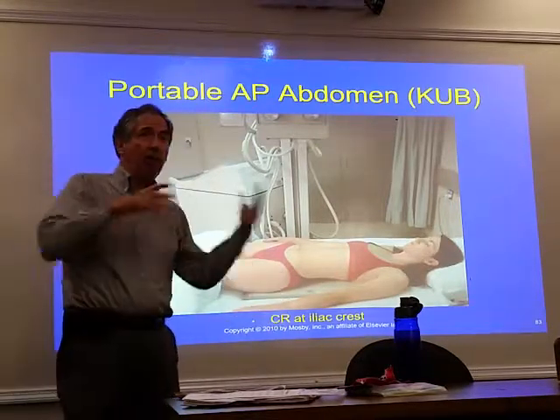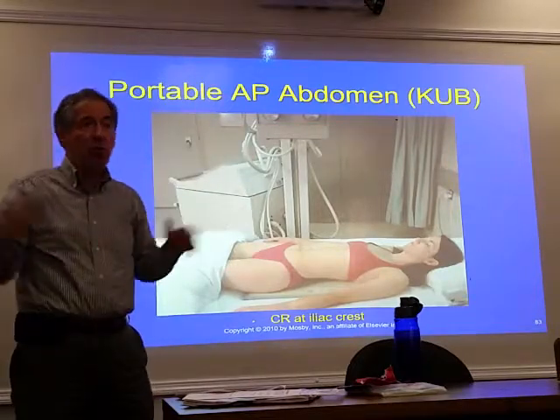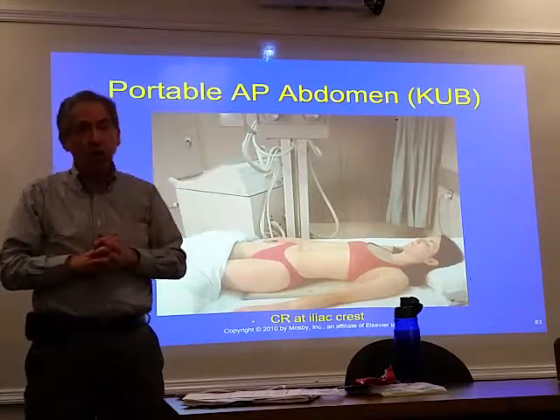Okay? Sometimes you're going to do a pelvis, and you're going to get the pelvis on lengthwise, which you can never do in the department, but on a portable, you can do it.